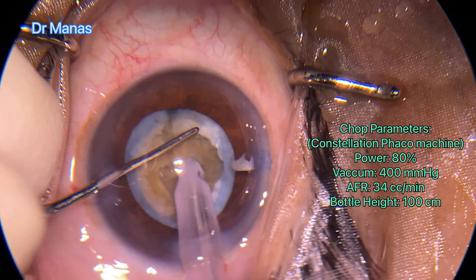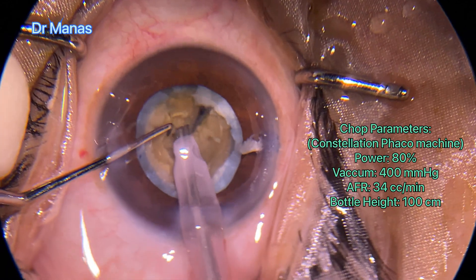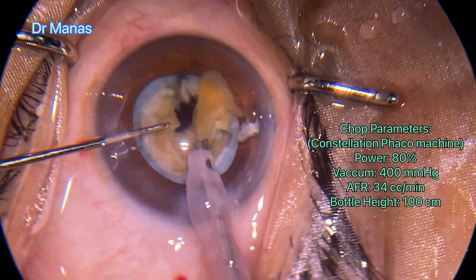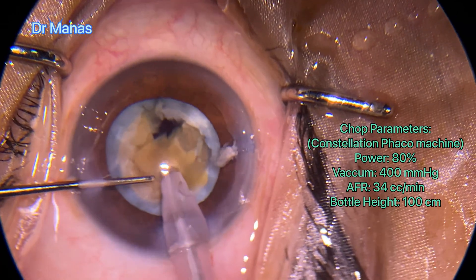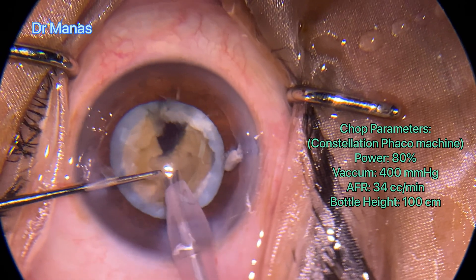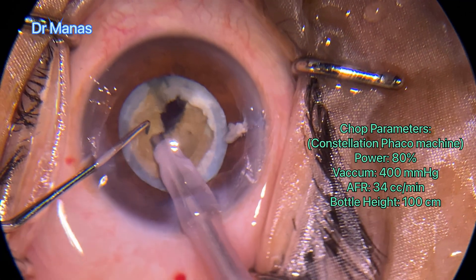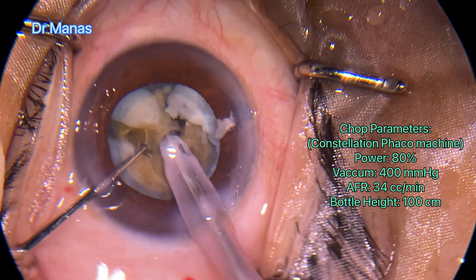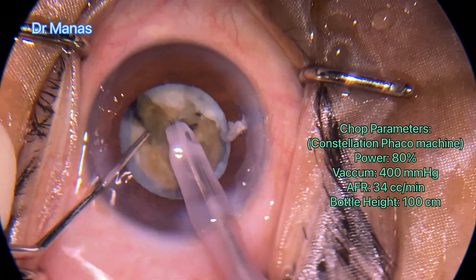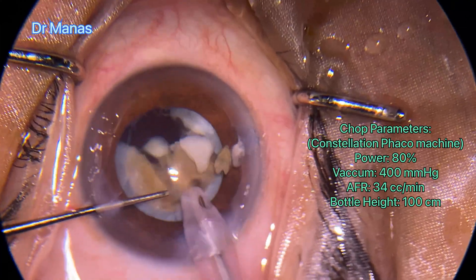I decided to debulk the bag by chopping and taking out one pie slice. Using both instruments, I tried to rotate, but it was still not freely mobile. So I decided to chop once again — going to a deeper plane to separate the posterior plate, which then got separated, and I emulsified it.